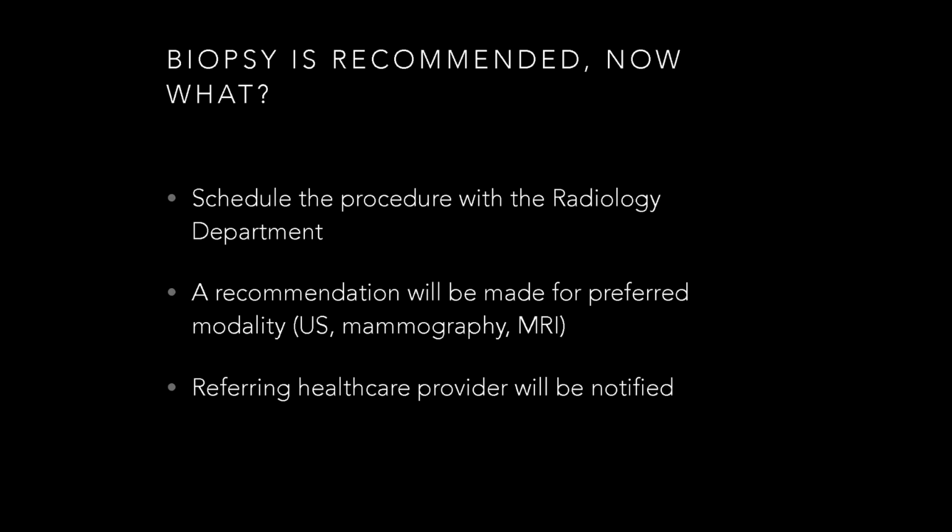Okay, so once biopsy has been recommended based on our breast imaging, now what? Usually we'll schedule the procedure in the radiology department, sometimes before you've left your diagnostic appointment, depending on the facility and depending on ability to get an order for that procedure. A recommendation will be made for the preferred modality that we want to use to do the biopsy. So ultrasound, mammography, or MRI are all options. And then the referring provider will be notified of the recommendation.